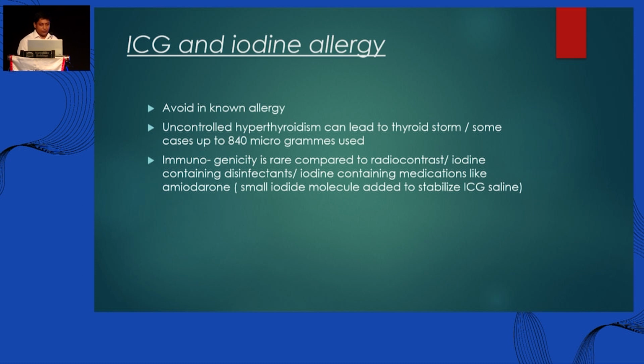That's something you should know. But immunogenicity or allergic reactions are much less, because radio contrast and all the others are big molecules which are immunogenic. Whereas in ICG angiography, what the iodine does is just stabilize the solution. It's a small molecule, so it's probably not going to do much in allergies.